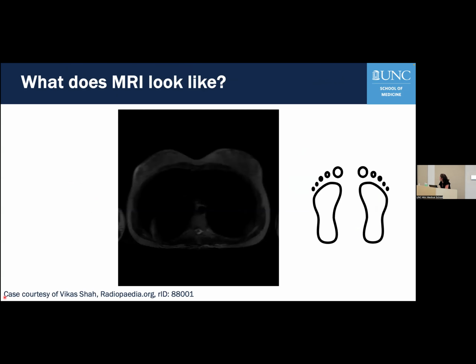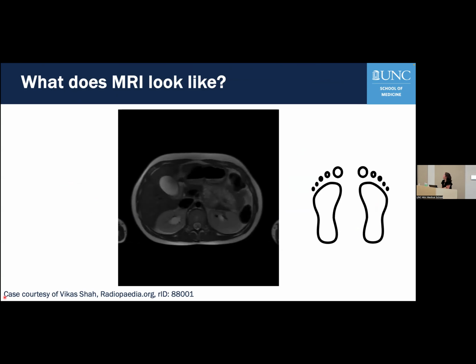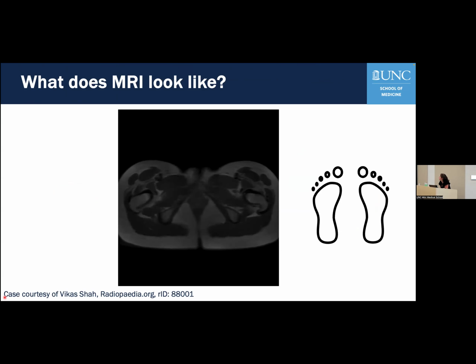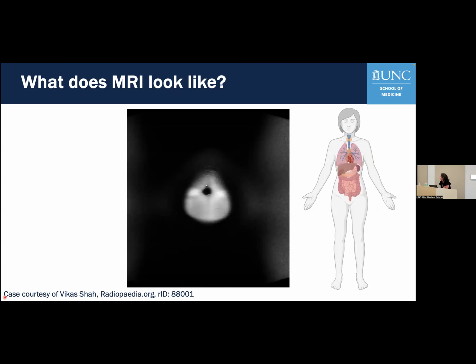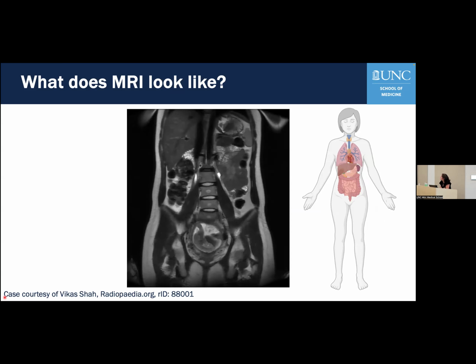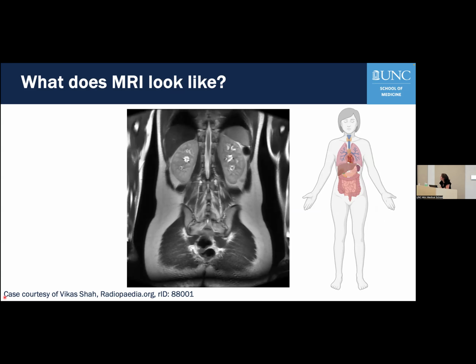So here's another example of MRI from that same view where we were looking with the feet down and you're looking up at their body and it's scrolling through. I want to see if y'all can notice anything special about this patient as we scroll. Okay. And I know that was very quick, so I'm going to go to the next one and see if you notice anything special in this next picture. So here, this is that view with the patient facing you, and you're scrolling through front to back. There's the MRI. And did anybody notice anything special here?